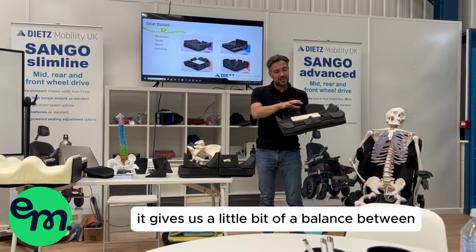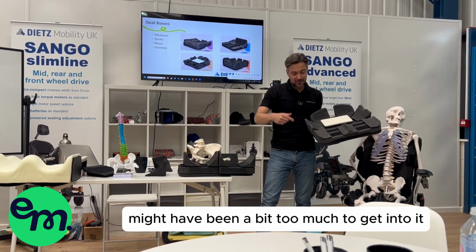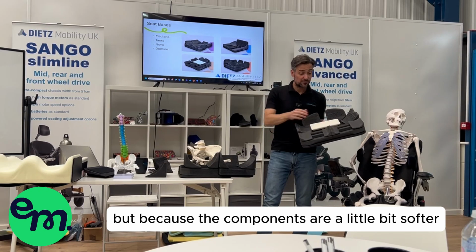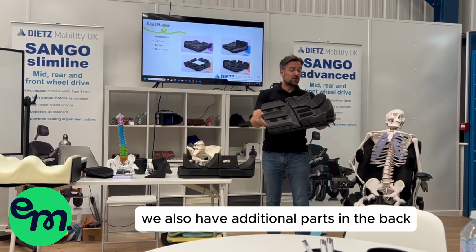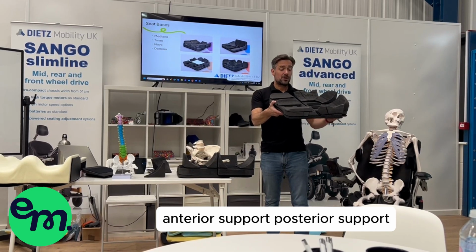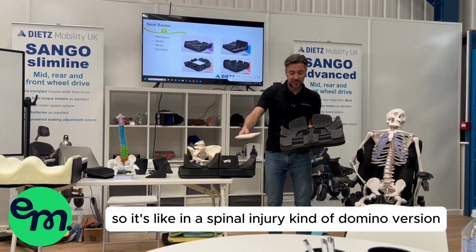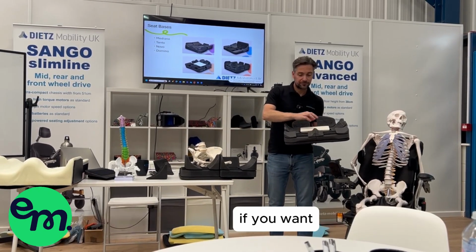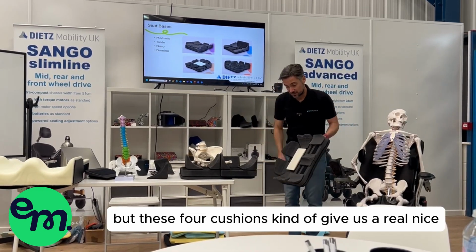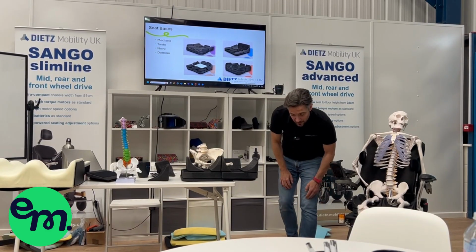But again, it gives us a little bit of a balance. The Mediano might have been a bit too much to get into for an active user, but the components here are a little bit softer. We also have additional parts at the back, so we can build up and create a little bit of additional anterior support, posterior support. You've got loads of stuff with that. So it's like a spinal injury version of the Domino, if you will. But these 4 cushions give us a real nice variation for assessment.